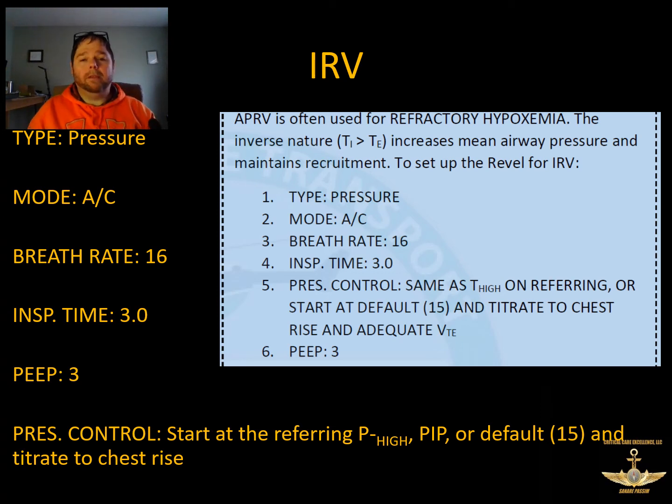So if we were to take our PEEP all the way to 0, during that 0.75 seconds, we would completely de-recruit, and you'd have to re-recruit every single time. And what we know about lung injury, especially ventilator-induced lung injury, is that when you have cyclical recruitment and de-recruitment of alveoli, this is where a lot of lung injury takes place, especially in adults.